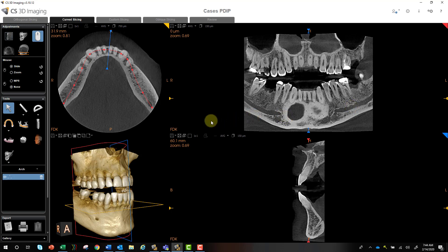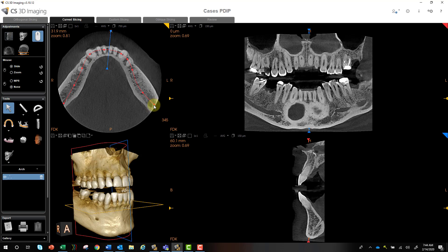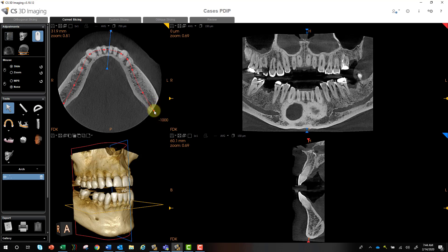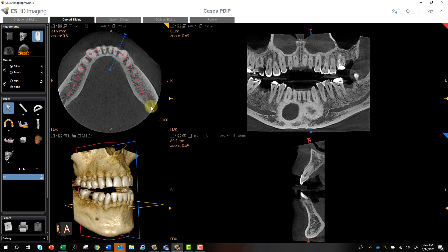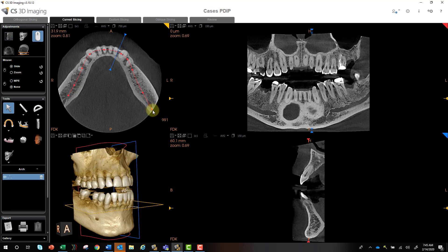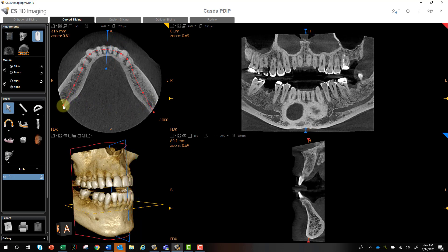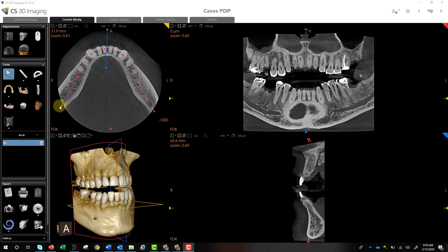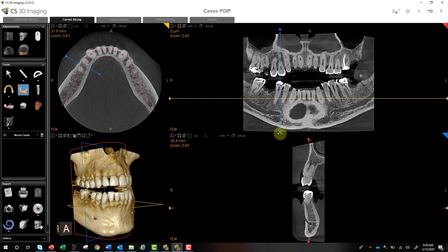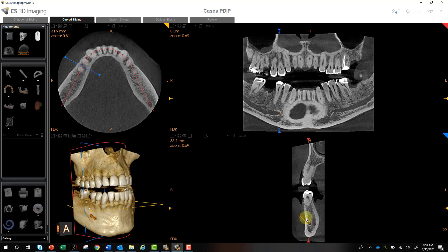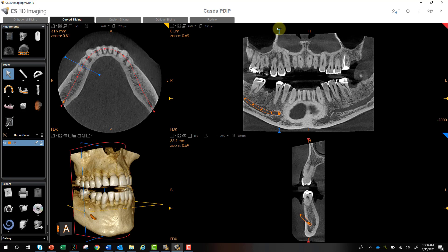When you map your panoramic curve, you can drag these little nodes to the buccal or lingual, and also drag all the way to the posterior to the edge of the scan. You want to make sure you're looking at the entire scan and not shorting yourself — for example, if I map it like this, I'm missing anatomy. So let's stretch this all the way to the edge of the scan. Now I can select my nerve mapping tool, begin at my foramen, and you can see the entire nerve is showing, which makes it easier to map.